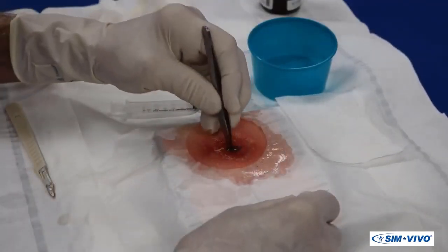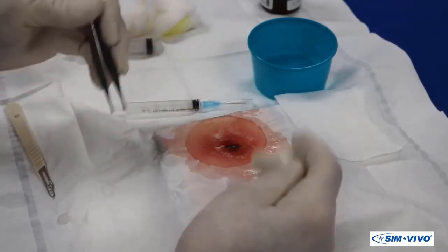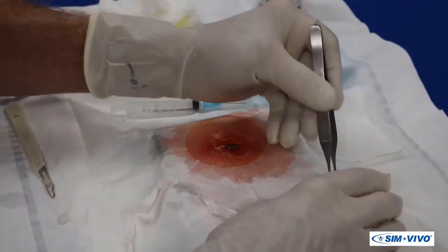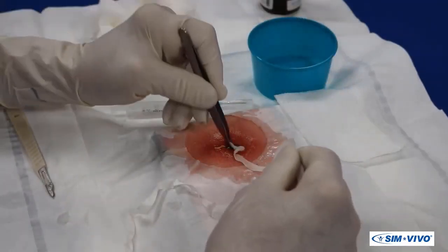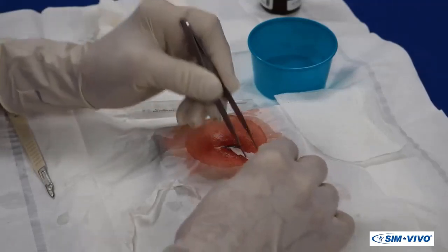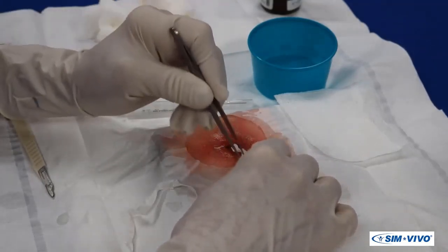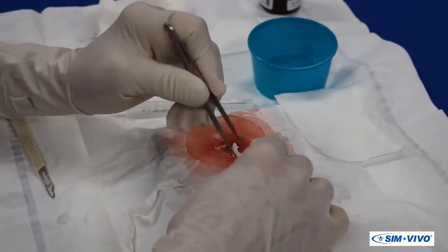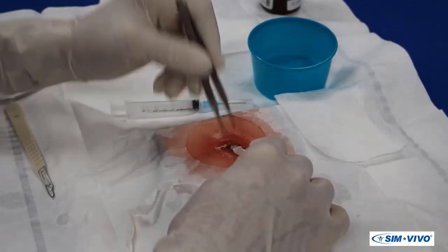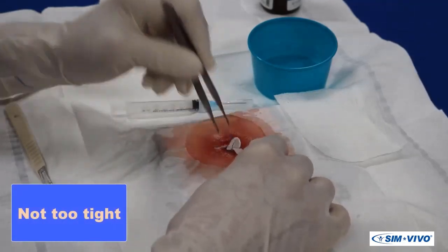You may want to insert the forceps or your little finger into the abscess to break up any loculations that will restrict complete drainage. With the forceps, grab the end of the packing strip and sequentially place it into the abscess cavity. The goal is to loosely fill the cavity to prevent premature skin closure and possible reaccumulation. Do not pack the abscess tightly unless bleeding needs to be controlled.